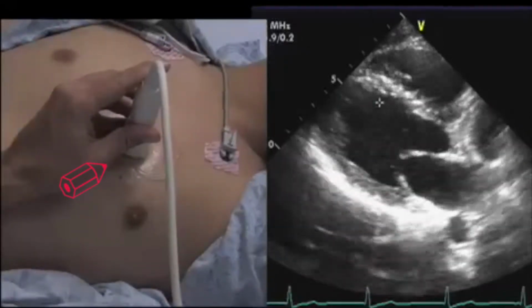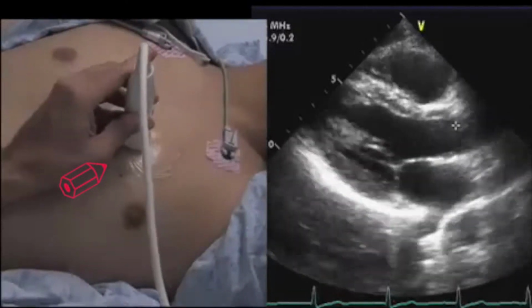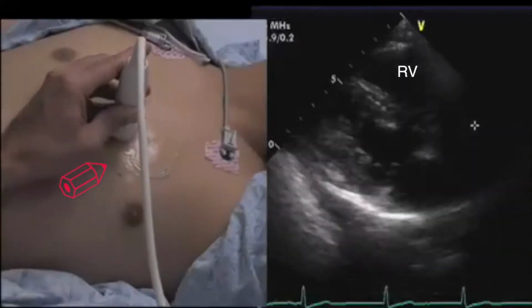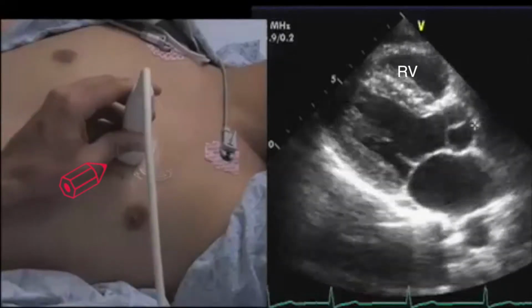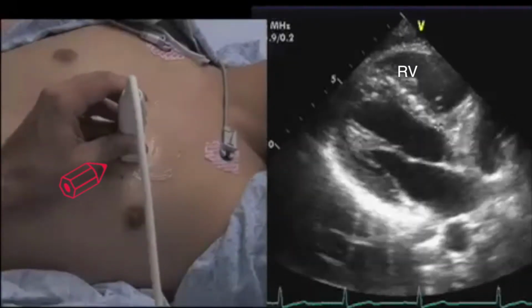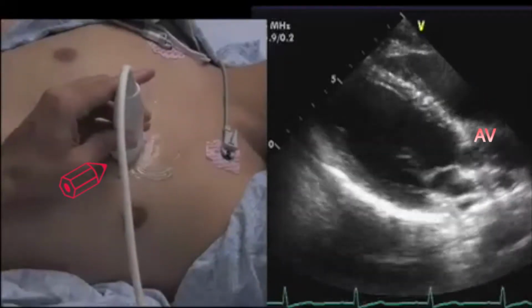I'm cutting it off. And I'm also cutting off the aorta a little bit. This, and many times, is a simple twisting of the transducer. You can see now I'm just twisting the probe, and that is what's causing that view. Let me go my circle and find my view again. That's what's causing the collapse of the left ventricle and the aortic root, it's just a twist.